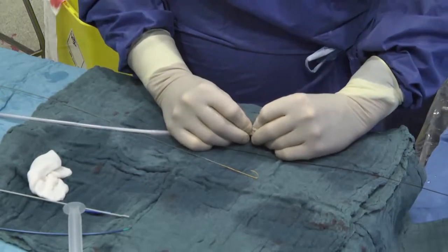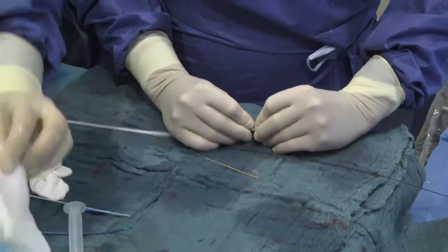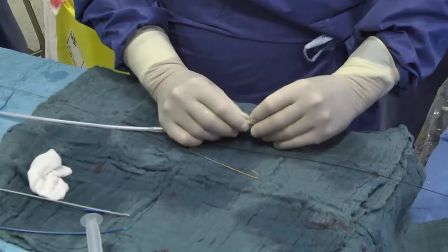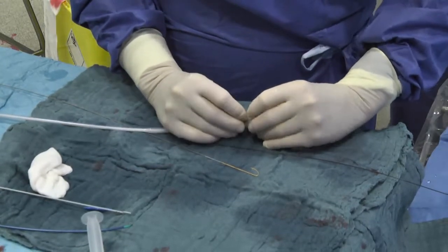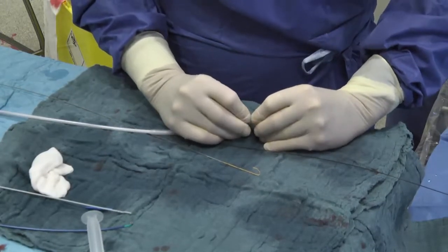right, that's actually a big plus, because I tell you, the more you do Edwards, you will have at one point a case where you cannot get to where you want and you cannot get it out of your body. Yep. So it's either you have to deploy it somewhere or a surgical cutdown or something. Okay. So we keep bugging Edwards to do a long delivery sheath, but they're not listening to us.